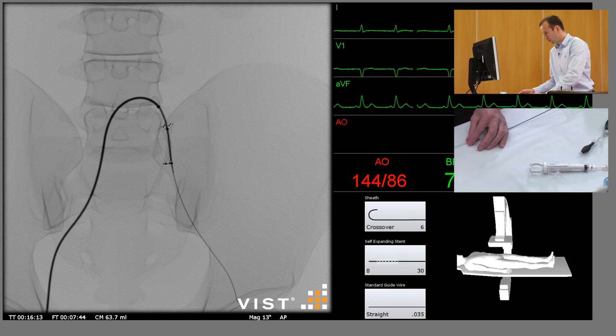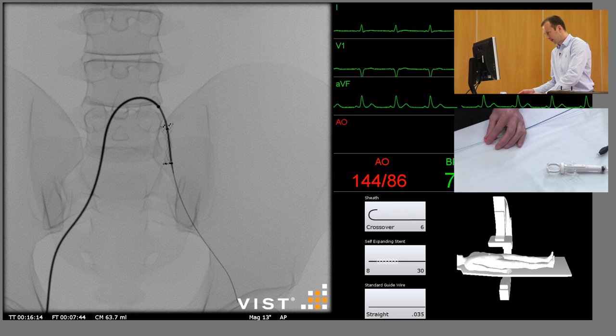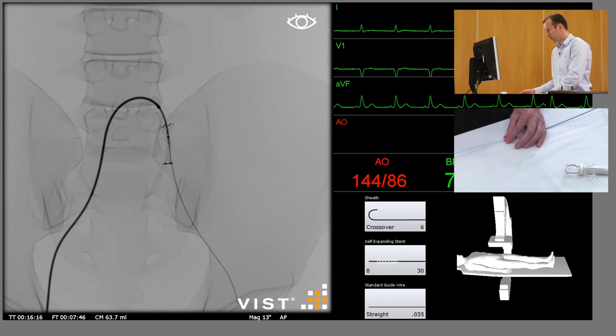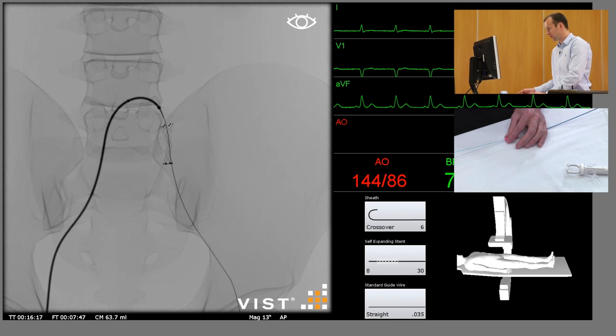And we can see the stent is nicely centered on the stenosis, but is not fully expanded.